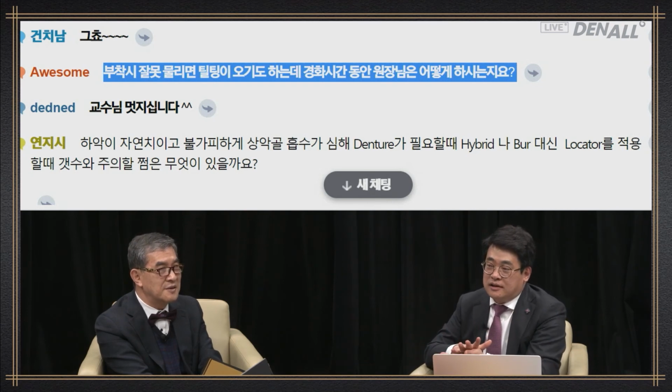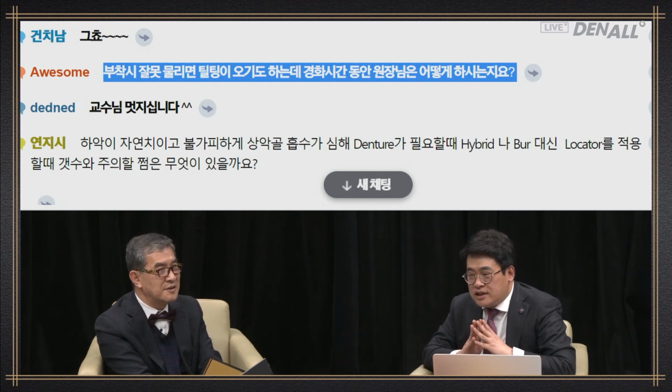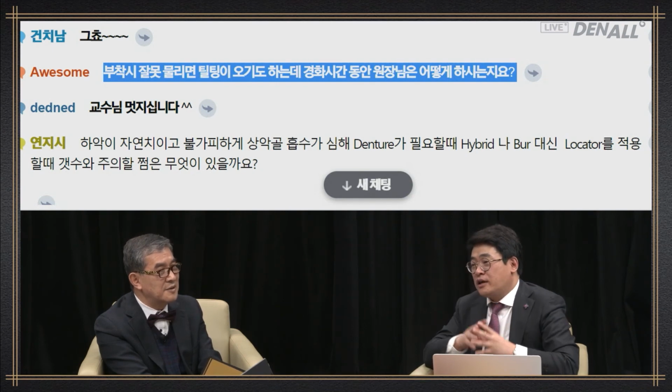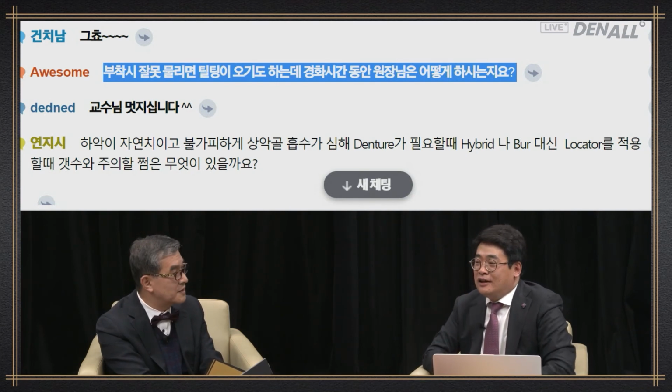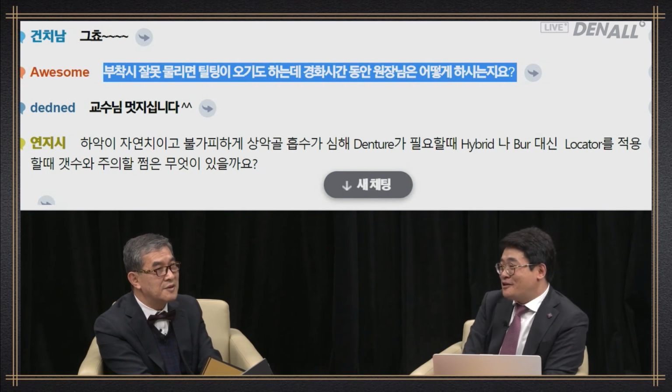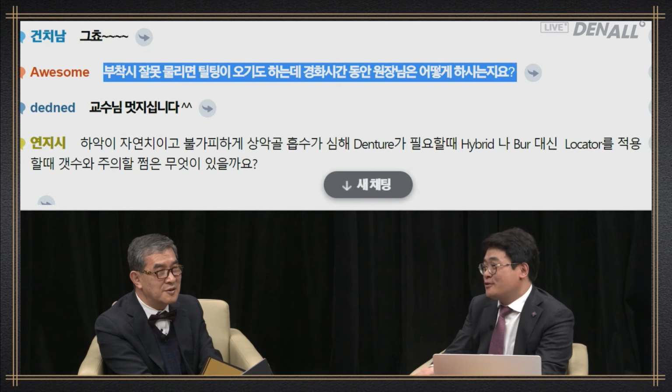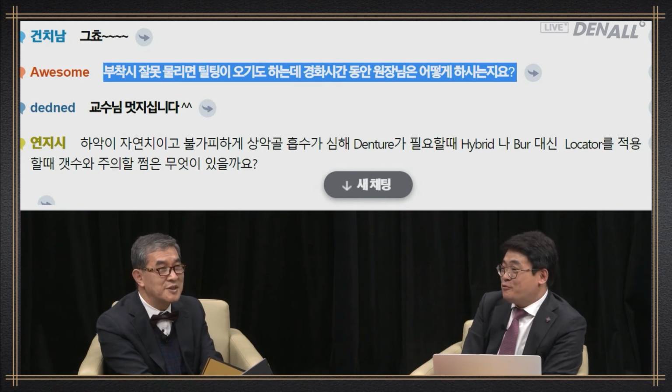If you find it imperative, you can have the patient bite on the cotton roll. That's a good way. You don't know what the patient is going to do, so I'm quite concerned. The best way is for you to hold it down. Yes, dentist or hygienist should press upon it.